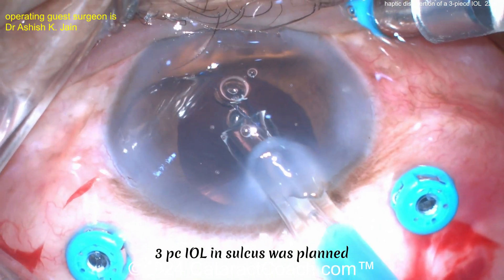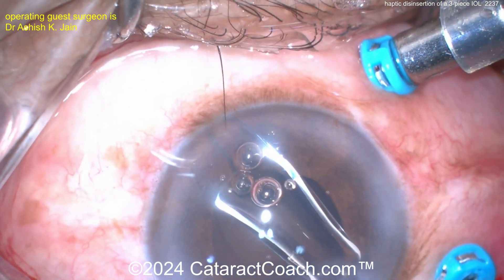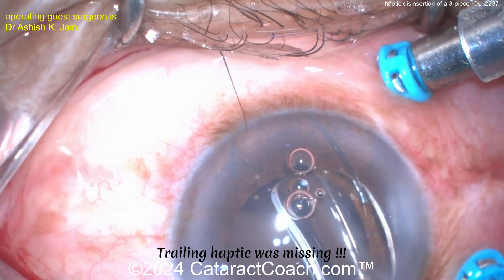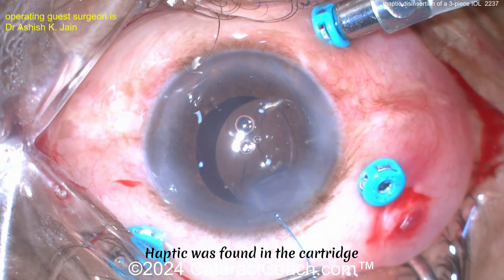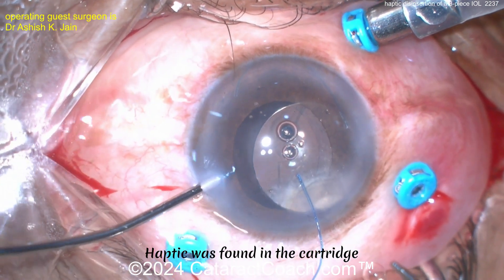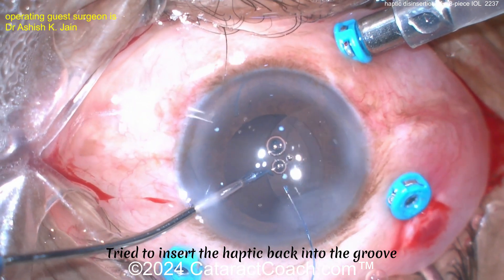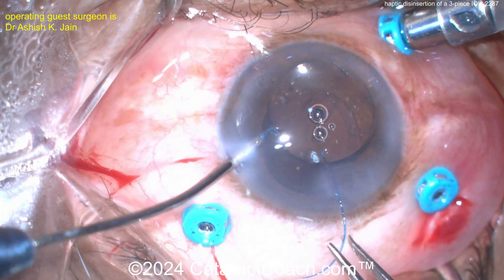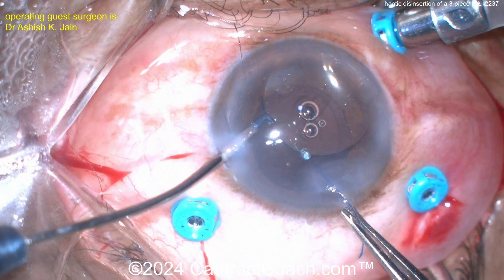There's the leading haptic — looks like the number 7, right? Yep, a '7' shape on that one. But where's the trailing haptic? Watch — there it is: it got stuck in the cartridge. The technician loaded the lens, probably not the best job, and as a result the trailing haptic is missing. So can you reinsert the IOL haptic into the optic?